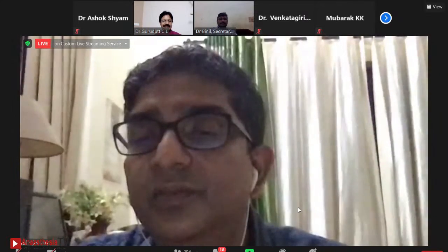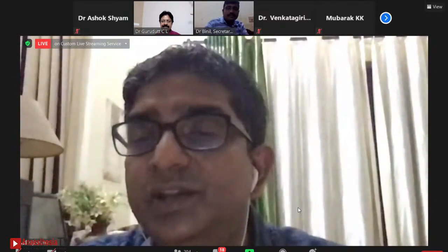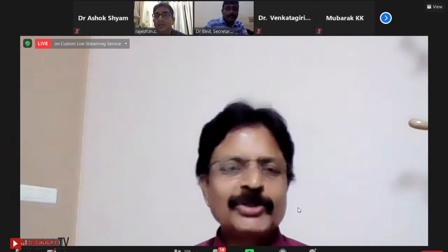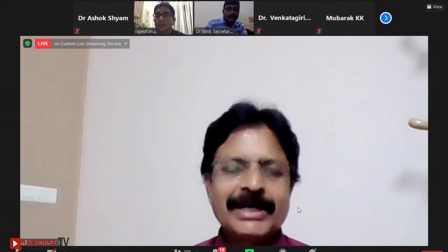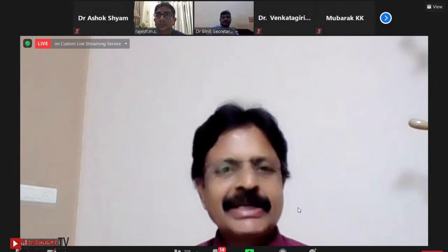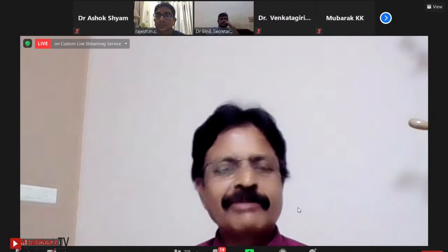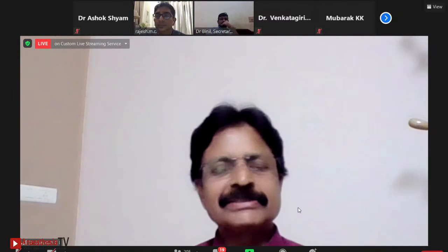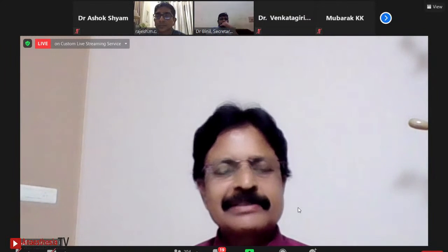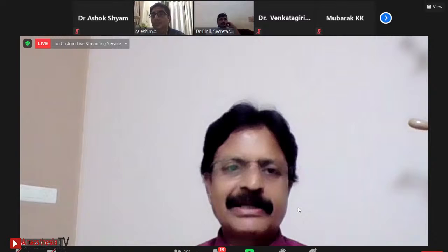Another question is from Dr. Vishnu Raj: are the master-slave mechanism and the fail-safe mechanism the same? The master-slave and fail-safe principle is almost the same. But in master-slave, this mechanism is there in the primary pressure regulators. For example, the primary nitrous oxide regulator acts as a slave regulator to the oxygen pressure. Whereas the fail-safe system is slightly different. A separate fail-safe valve is there, other than the primary regulator. That is the difference.